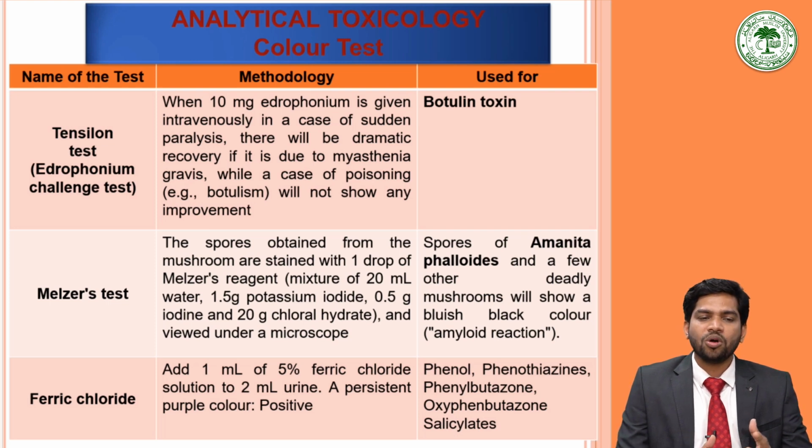Then there is a long list of such type of tests. I will be sharing a list of color tests in the reference section, particularly mentioned in the Basic Analytical Toxicology published by the World Health Organization, so that you can take the reference of it.